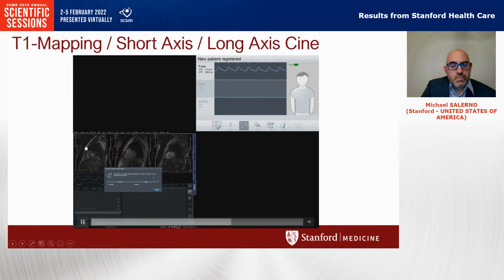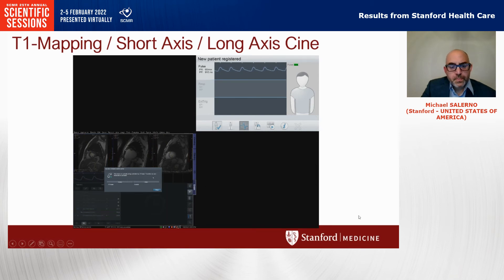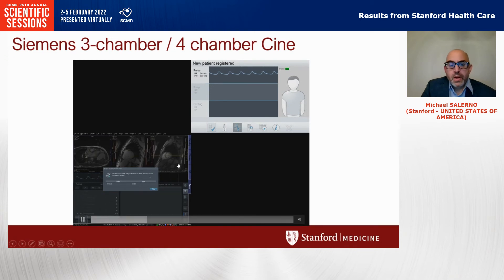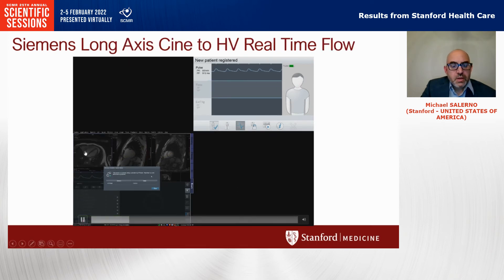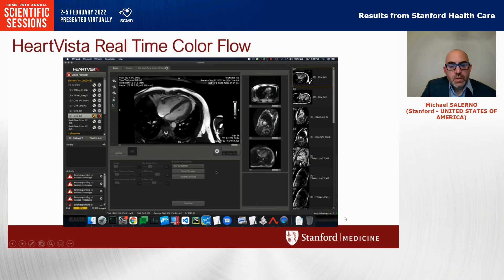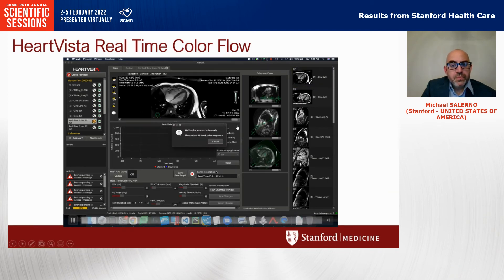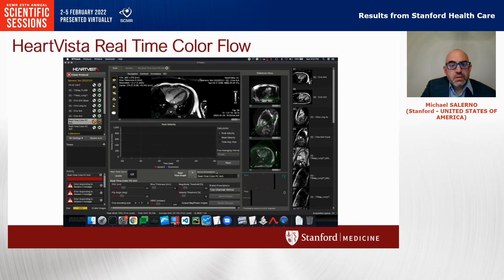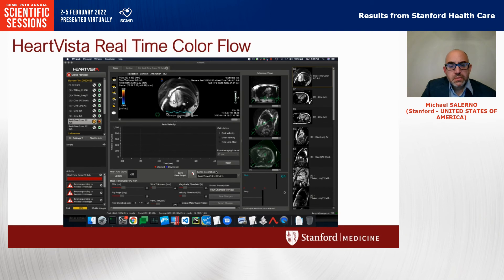Now it's automatically planning the three-chamber view. After acquiring the three-chamber, it sets up the four-chamber, and then we have the four-chamber view. Now we're turning the scanner back over to a HeartVista sequence — the last CINE in four-chamber has come up, and it's now going to run the HeartVista real-time color flow sequence. That gives you a basic demonstration of how we're running the scanner using Siemens sequences from the HeartVista framework.